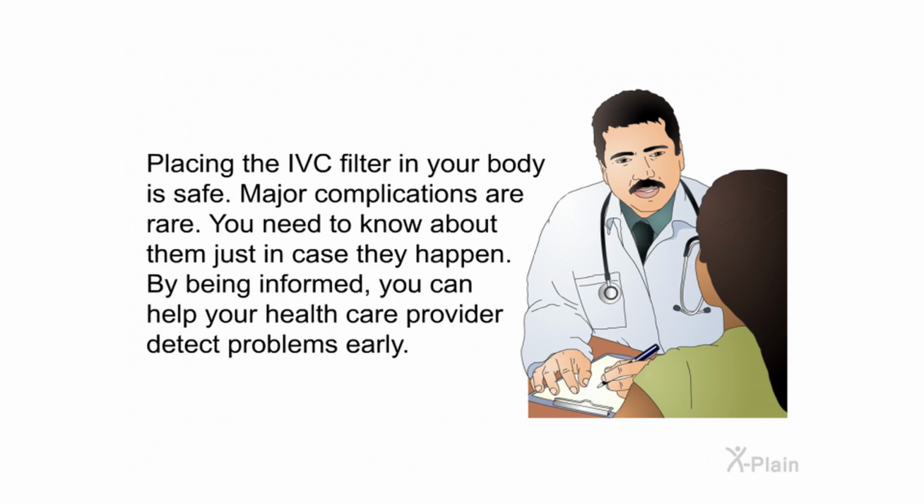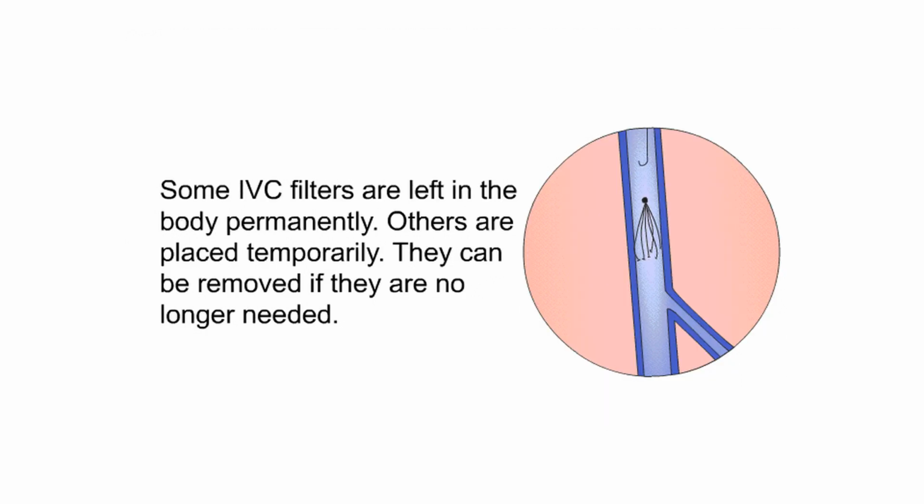Placing the IVC filter in your body is safe. Major complications are rare. You need to know about them just in case they happen. By being informed, you can help your healthcare provider detect problems early. Some IVC filters are left in the body permanently. Others are placed temporarily. They can be removed if they are no longer needed.